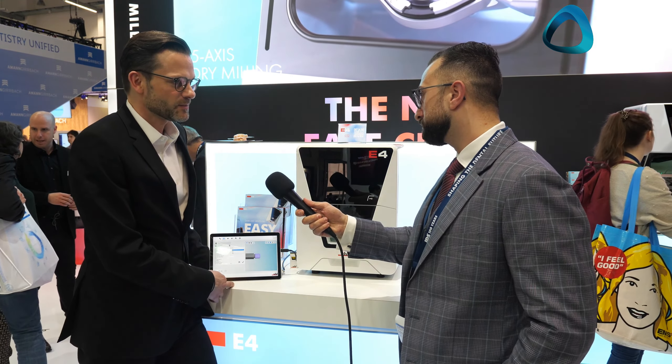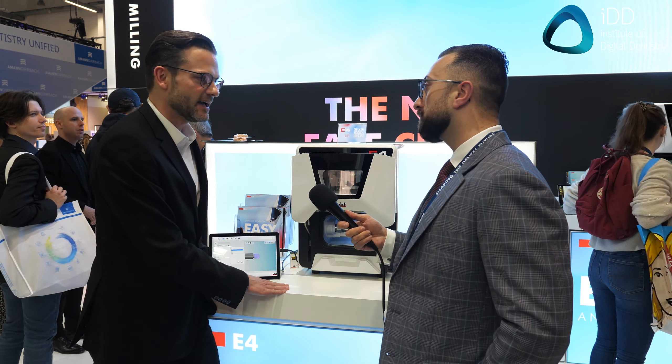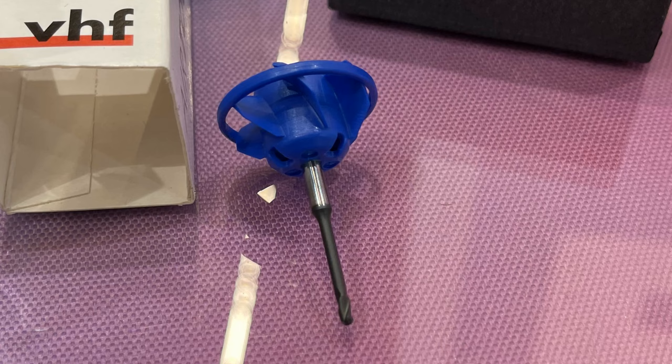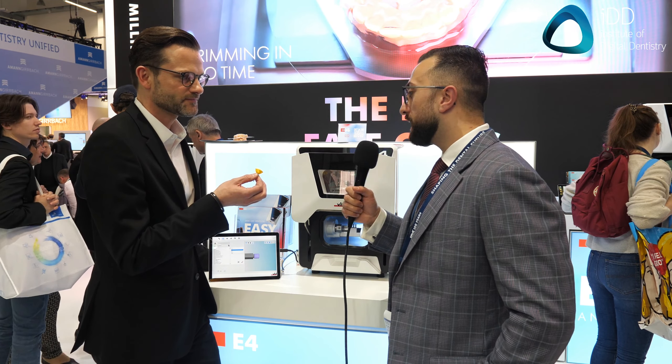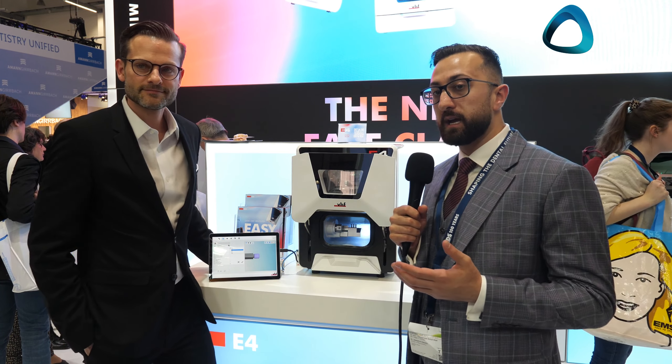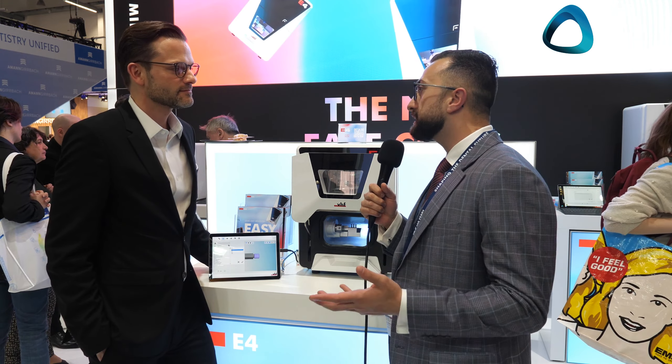You heard that correct — it's 28 kilos, which is kind of crazy. On the chairside version, it comes with a surface tablet with a customized version of our dental CAM software. We also manufacture our own milling tools. It's wet and dry — you have the standard wet operation, and then you can upgrade to a dry milling kit. No compressed air is needed because we have something very exciting called air tool technology that basically generates the compressed air in the machine — a rotor permanently fixed on the milling tool that, with the velocity of the spindle, keeps all the dust away from the block. And I understand that's a patented technology? Correct — patent pending.